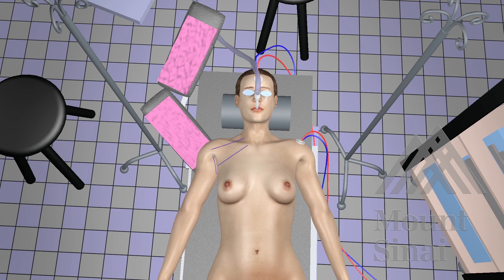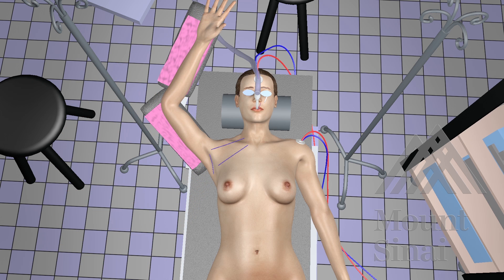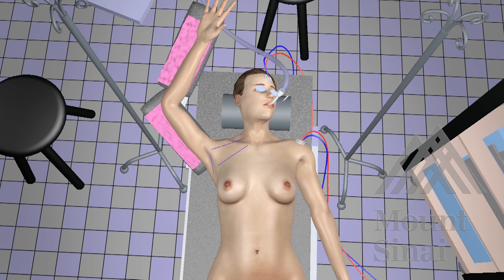Once completed, reposition the patient so that their right arm is padded and in the abducted position, extended above their head and flexed at the elbow in a relaxed manner. The patient's head is turned slightly to the left to allow for better exposure to the right thyroid lobe.